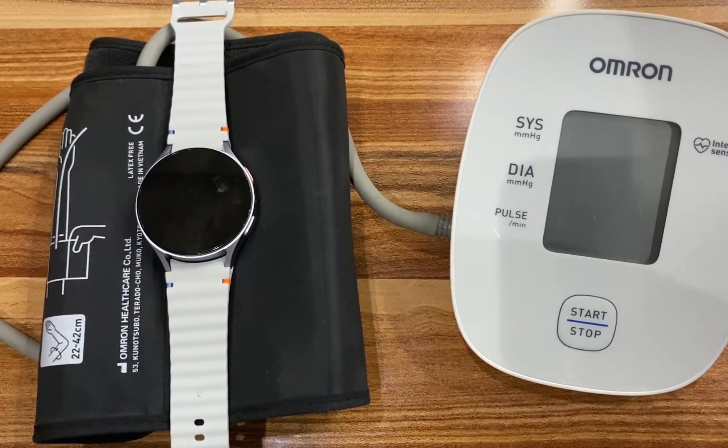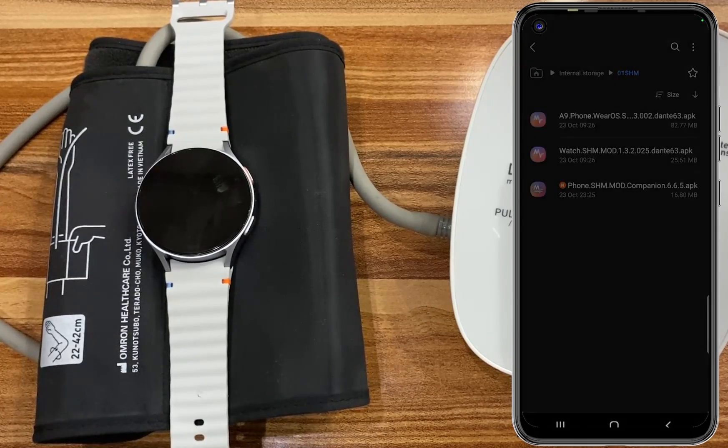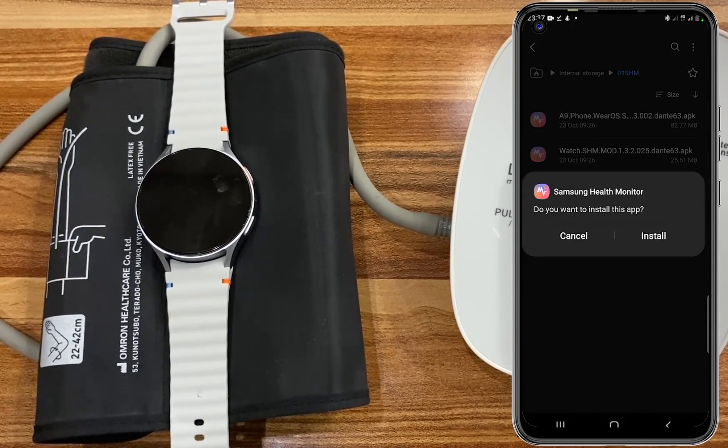I will go ahead and install the SHM app on my phone. I'll simply go to my folder here and you can see the first file. I'll select it and click on install, and this will be installed on my phone.